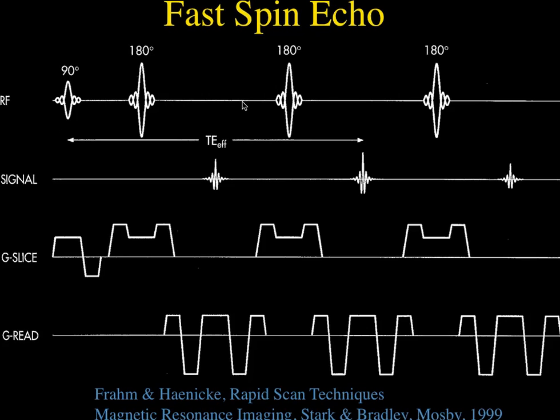If you remember, the high values for phase encoding fill in the periphery of K-space, which is important for resolution, not for contrast. So you typically cluster the 0 K-space or the low phase encoded gradients around the contrast you want. If it's T1, the TR is going to be short. If it's proton density, you use a longer TR, typically around 3 to 4,000 milliseconds, maybe even longer.